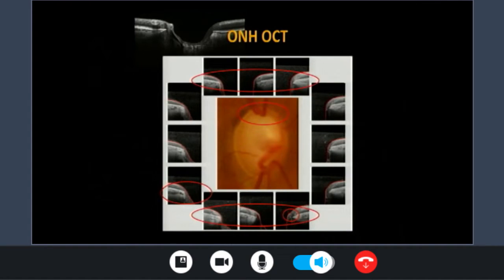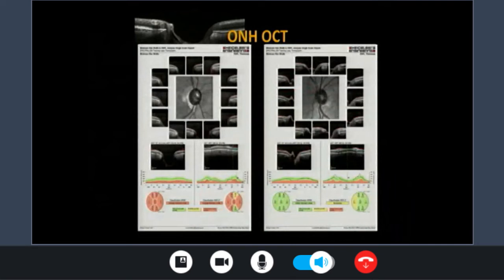If you look at the visual field parameters, look at this area. When you look at the SD-OCT printout, you will have almost 12 sectors represented: superior, inferior, nasal, and temporal. Look at the rim here. It's almost not existing at all. So she has complete loss of the rim in this area. She still has some rim here, and some rim here. Superiorly, there is a very narrow rim, but compared with the inferior part here, the rim has almost completely disappeared. That's why the visual field defect is mostly localized superiorly.